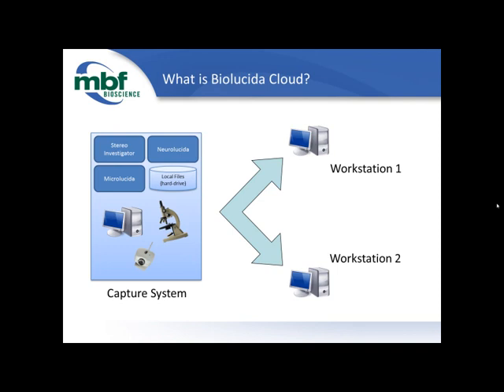And that's perfectly logical. Well, let's say that you were capturing multiple virtual tissues at a time, and each one of those images was multiple gigabytes in size. Sure. No, I see what you're getting at. That would, I think, very quickly become tedious with image files of that size, especially if I had to move between several workstations on any given day, which again is totally possible.